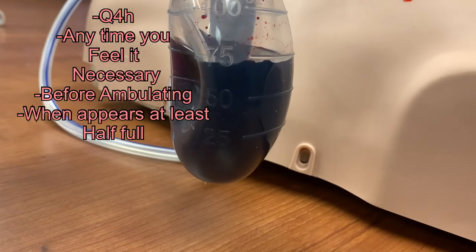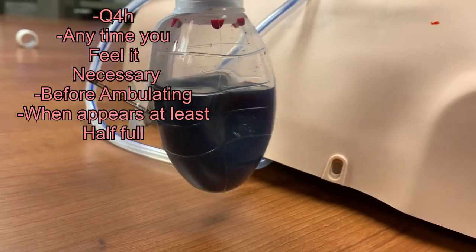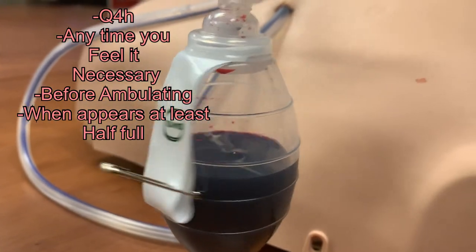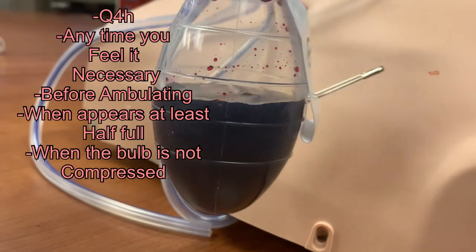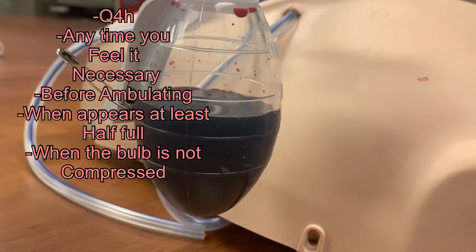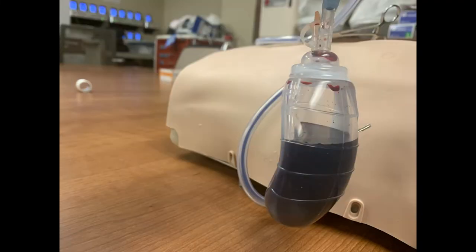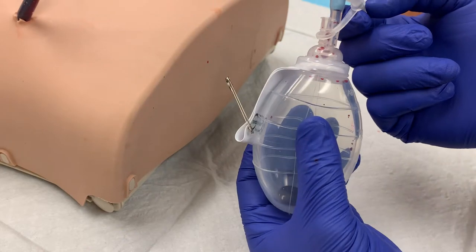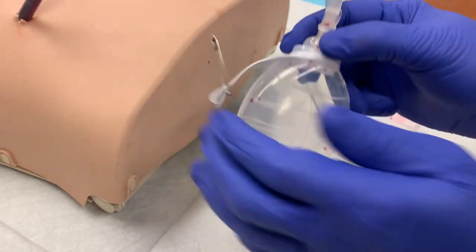If the drain is more than half filled, empty the bulb. Anytime you're in the room, make a habit of checking the drain to see how full it is. If you notice the drain is almost fully expanded or is fully expanded, empty the bulb and compress it to continue providing negative pressure. The bulb is only effective if it is compressed, and the more it is filled, the less it is compressed. By regularly emptying and resetting the bulb, you are ensuring that it is always applying negative pressure and draining fluid from the operative site.